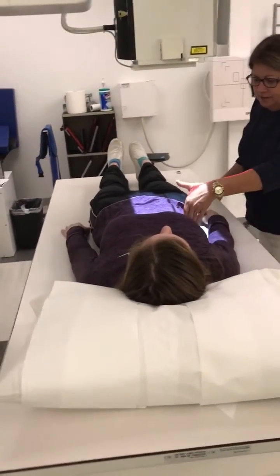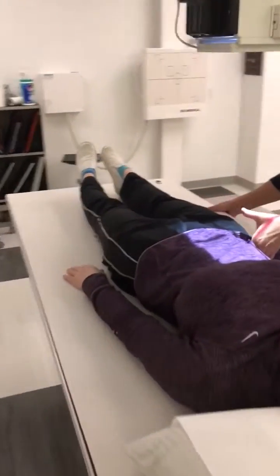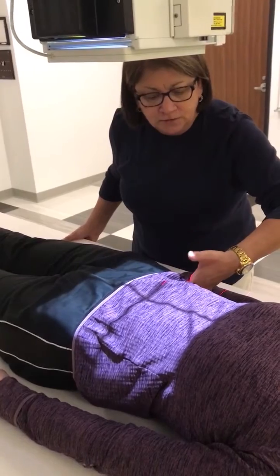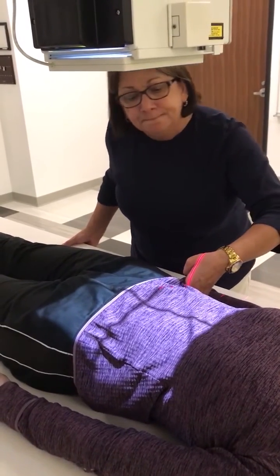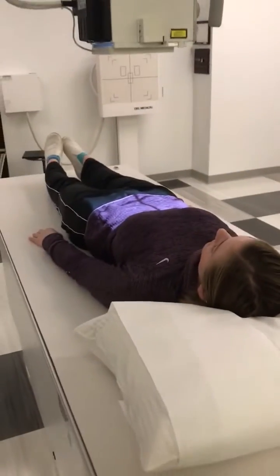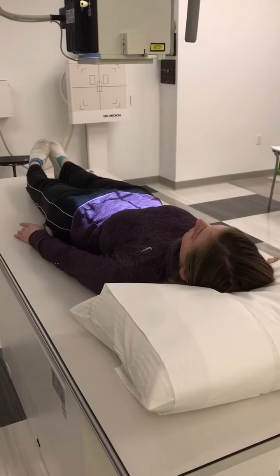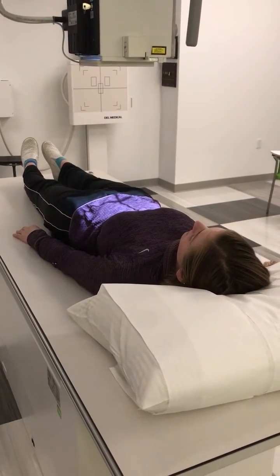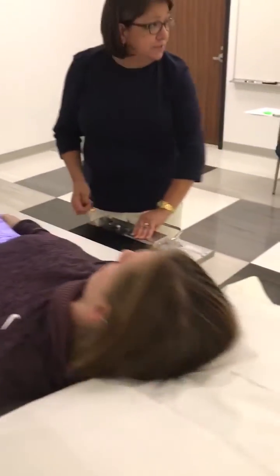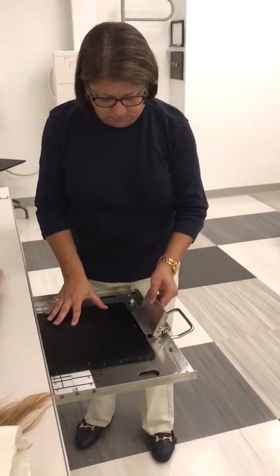I'm going to palpate for the iliac crest. I'm centering at the iliac crest and at the mid-sagittal plane. Taking a deep breath. Blow it all the way out. Hold it out. And breathe, exposure. You may breathe. The next image is the nephrogram, the kidneys.